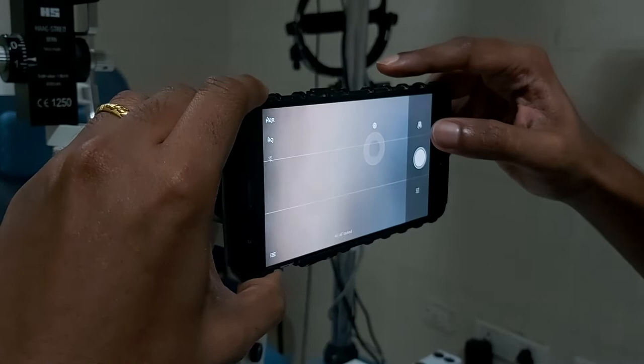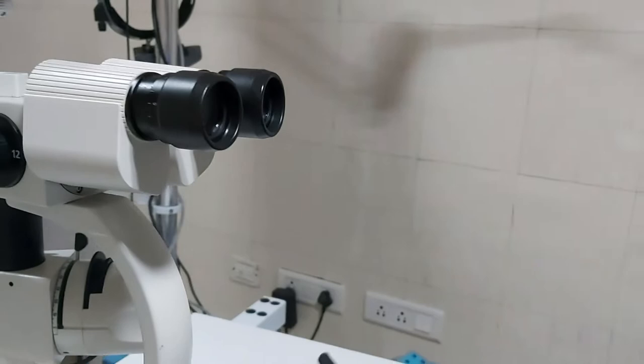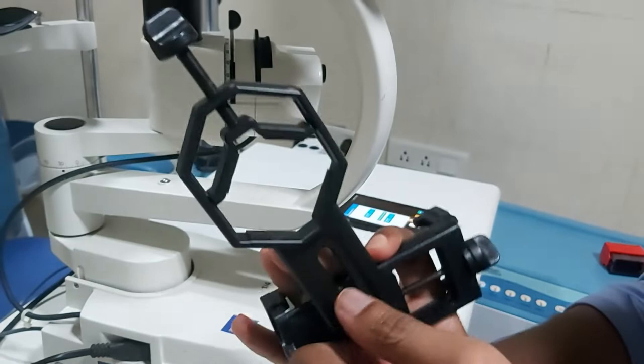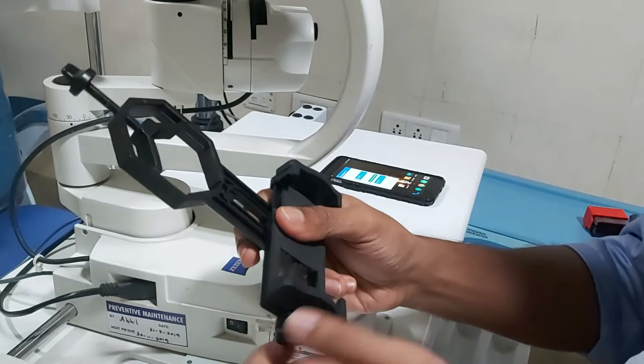If you find it difficult to use the phone freehand, you can always use an adapter. This adapter has three knobs: one which adjusts the position of the eyepiece holder, one which adjusts the position of the phone holder, and one which holds the eyepiece.